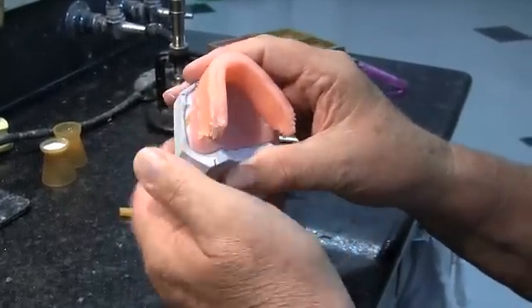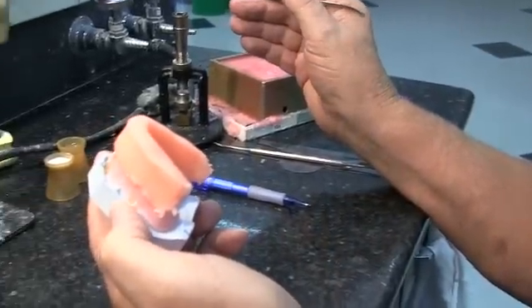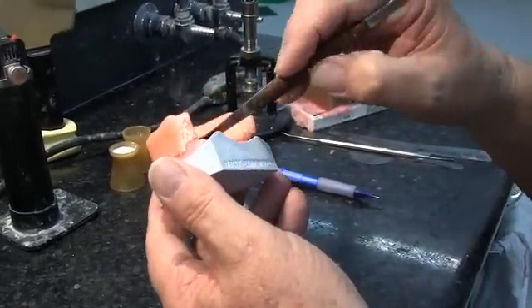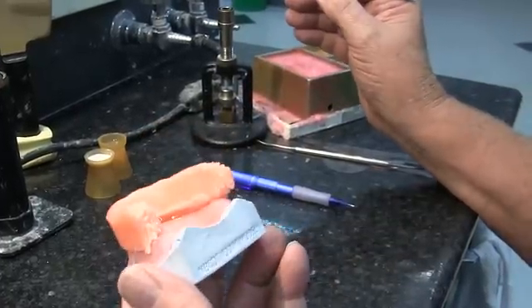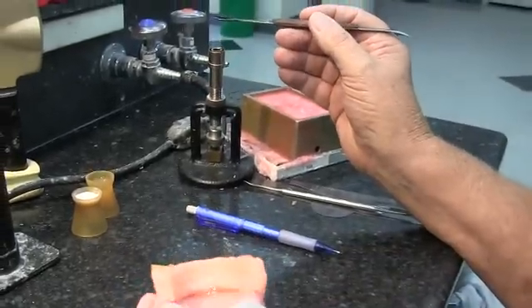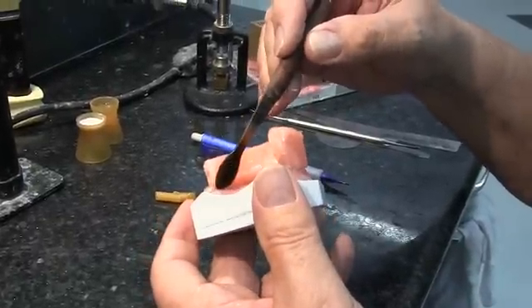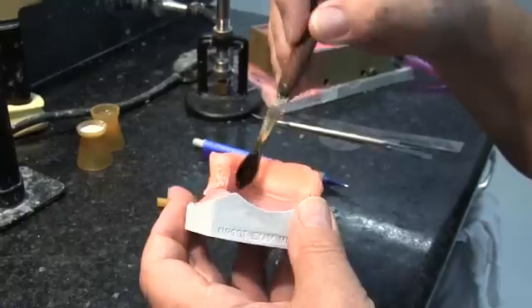Now we're going to seal that all the way around with a spatula — take a hot spatula and melt the wax so it seals down to the baseplate. We don't want this to break loose in the mouth; that would be very embarrassing. We want to make sure it's well sealed and attached to the baseplate.